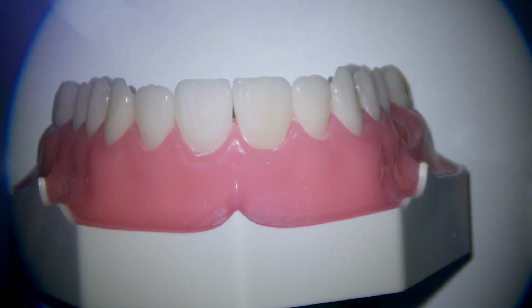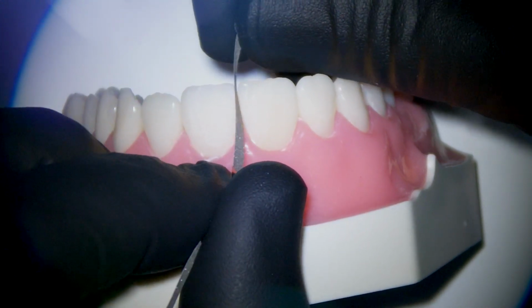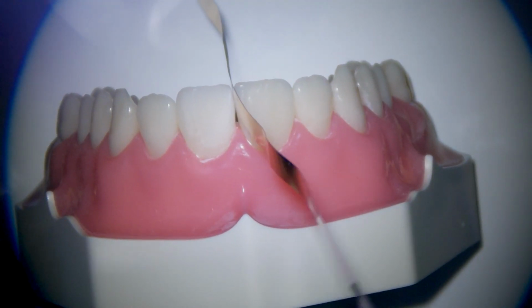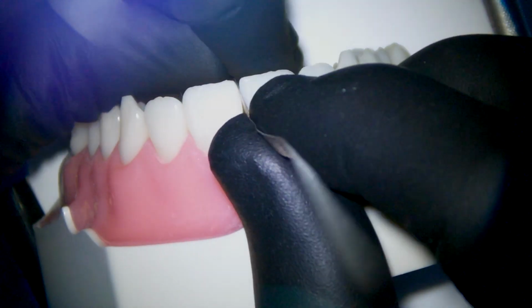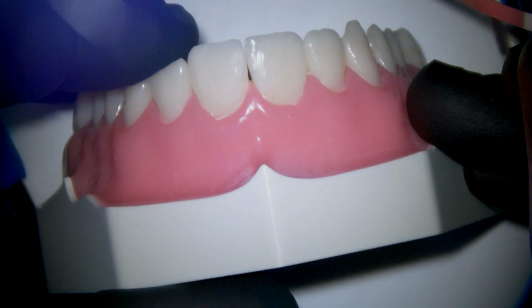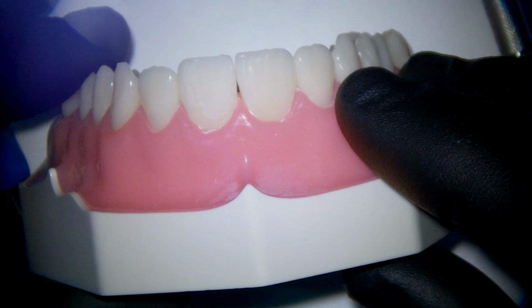Okay, once I've gone through the contact, now I'm going to use a fine diamond strip against the tooth that I just did the new bonding. So I'll introduce the strip. Oftentimes it's such a tight contact that my assistant will have to come in and do a little torquing between the teeth so I can get the strip in, and I want to just very lightly, very gently run my strip in through that contact. I'm going to do a final polish of the contact after I finish my contouring.